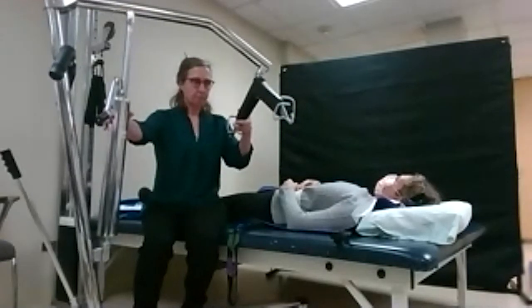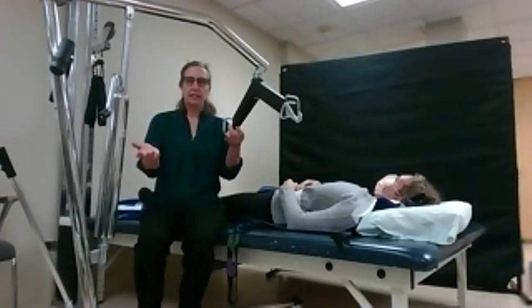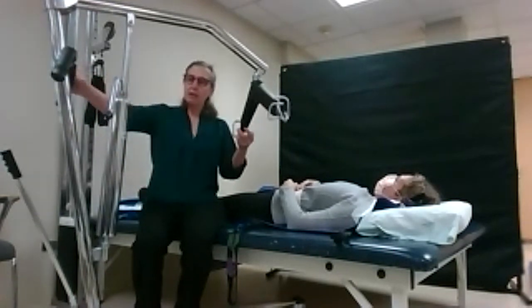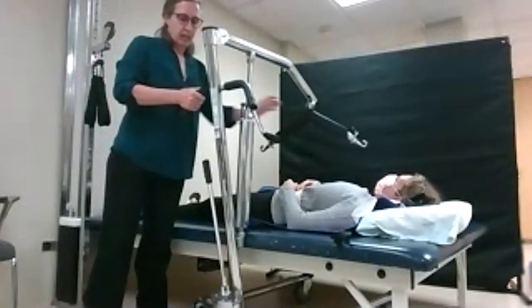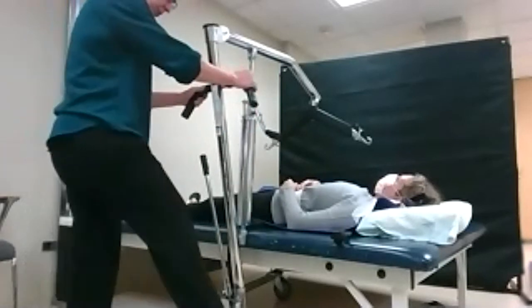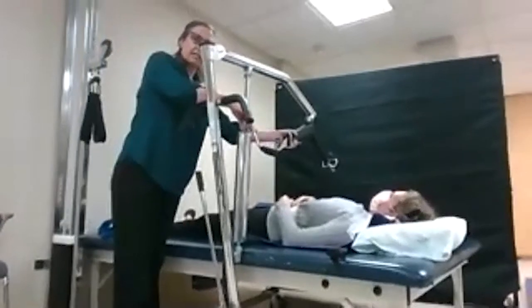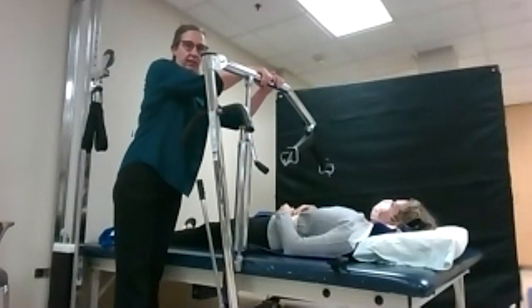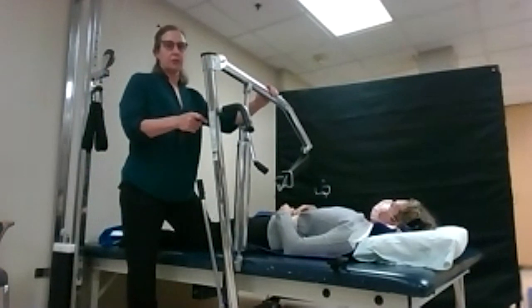This is a patient lift system, and there are a few key components you need to know about. They do make these electric, but that requires power, and sometimes that's not always available. So this tried-and-true manual version uses an air mechanism to lift. They are designed so the base goes underneath the area you are trying to reach. You can maneuver the base wider to give it more support, then put the brakes on to keep it steady. There is a lever to pump it up and a mechanism to lower it. Some models can go all the way to the ground; this one is basically just to get you out of bed.